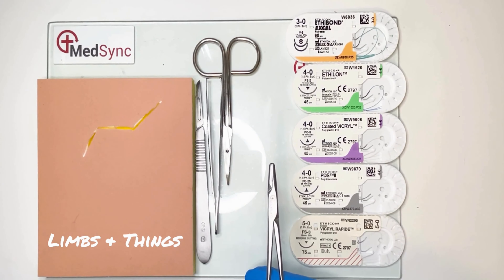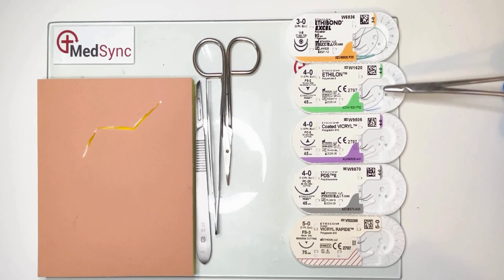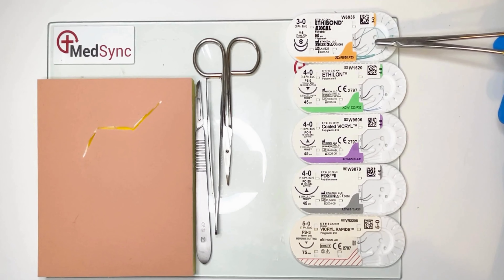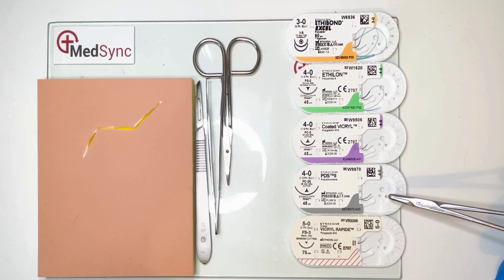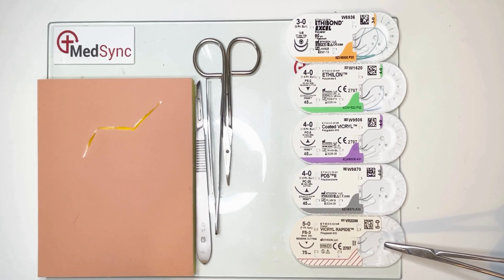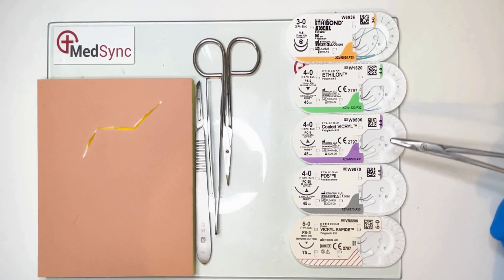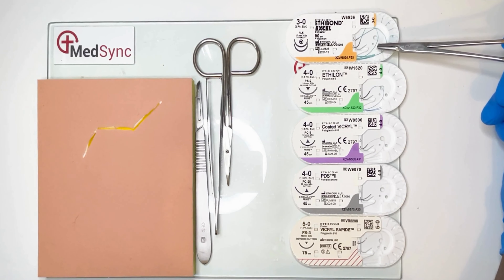Suture selection is equally as important as the techniques used to close wounds. Sutures can be organised into four groups: dissolvable, non-dissolvable, monofilament, and braided. Examples include PDS (monofilament and dissolvable), Vicryl Rapide (braided and fast dissolving), Vicryl (braided and dissolving but longer lasting than Rapide), nylon (monofilament, non-dissolvable), and Ethibond (non-dissolvable, braided).